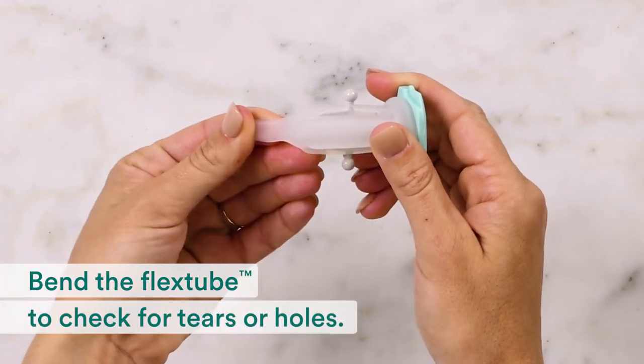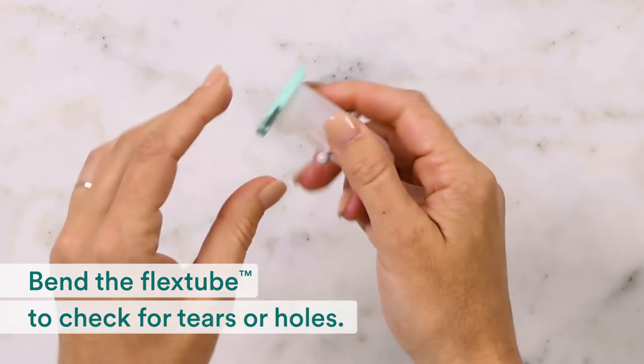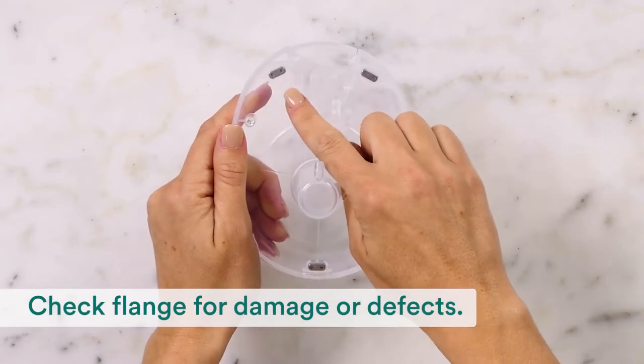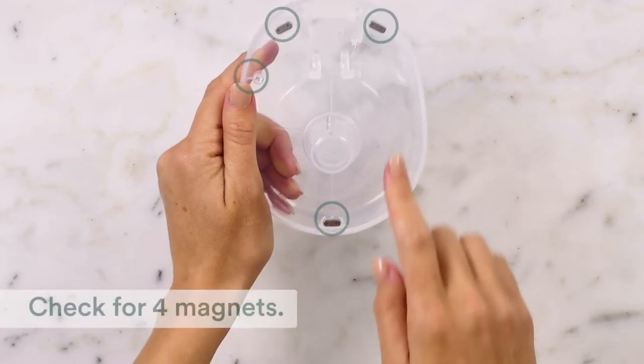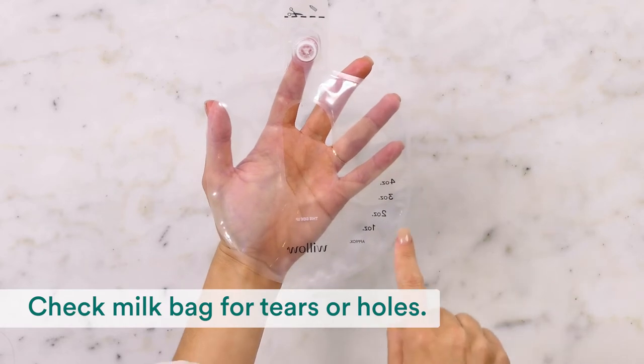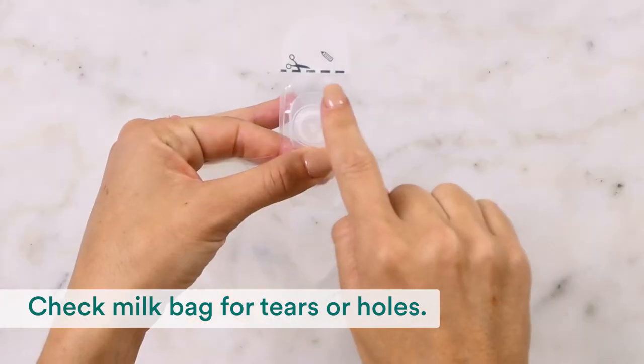First, check the flex tube for tears or holes — bending it makes it easier to see any damage. Also check your flange for damage or defects, and check that it still has four magnets. Then check your milk bag for tears or holes, especially near the valve.